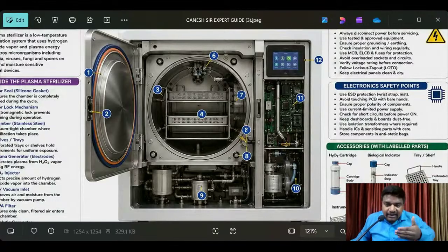That is the basic level. Next, one by one, we have a lot of skills like electrical, electronic, how to check everything, and how to diagnose. Because in biomedical engineering services, the diagnosis process is a very challenging task. Many engineers fail here. Understand? Many engineers fail here. Why? Because a biomedical engineer is a problem solver, finding out the issues in medical equipment. For that purpose, you have to keep all this information in your mind.